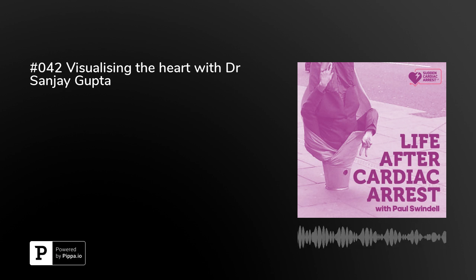But basically, it involves going through a scanner. The heart is slowed down because, again, the heart is a moving structure. And if you want to visualize the arteries, if you don't slow the heart down, then the arteries will move with the heart and you'll get blurred images. So what they try and do is they slow the heart down. And therefore, in that short period of time when the heart is very slow, they try and image these arteries. The arteries are imaged by giving the person a contrast agent through one of their veins, and that contrast agent goes through the vessels, and you can then take pictures of the heart arteries.